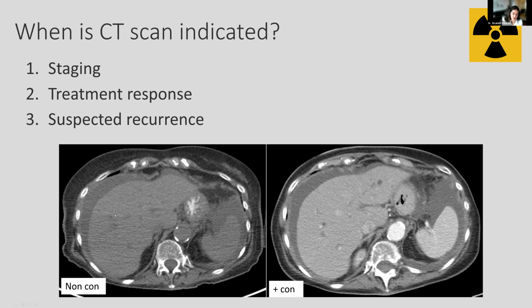This image just below is to show you why we typically do it with iodinated contrast. Sometimes I think patients are a little bit worried about iodinated contrast, and often are asking why they don't have to do it. And this image is just to show that this is a non-contrast CT. So they drank oral contrast, but we didn't inject them with IV contrast like we did in this study, because you can see this is their aorta, which is the main artery supply in the abdomen.